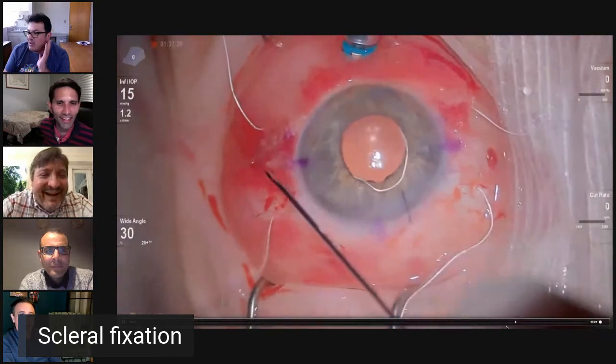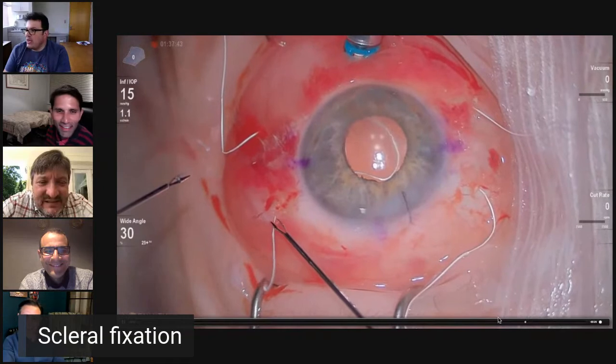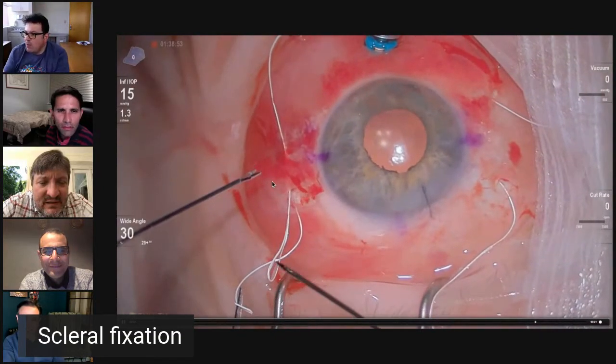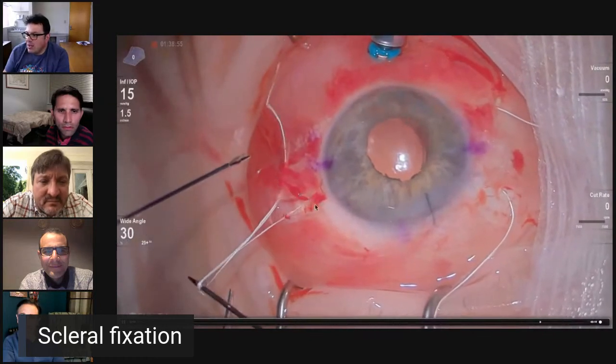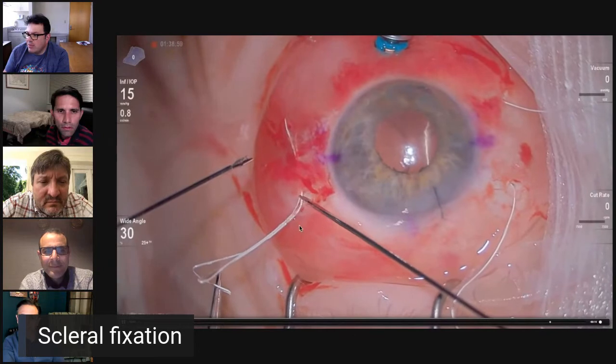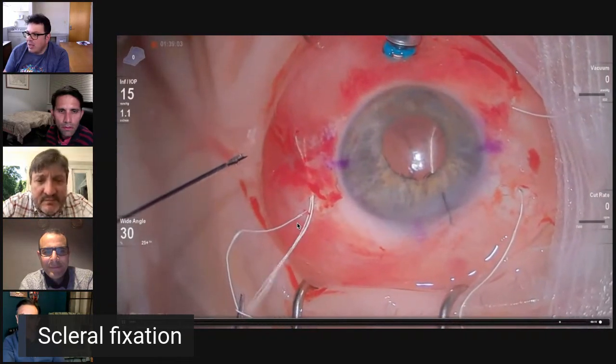Yes. And then I just want to show here what I do now with the conjunctiva. I have an opening only here, and I don't have an opening here, and I do it the way that Chris was doing, because I found doing it without an opening is a bit tricky. It is. In my hand.